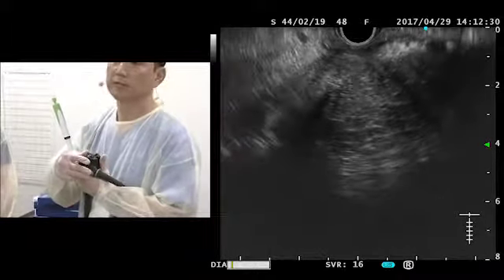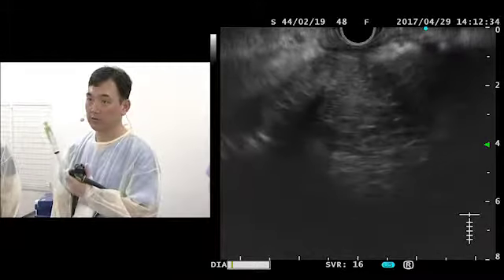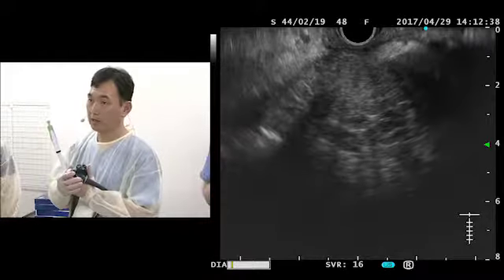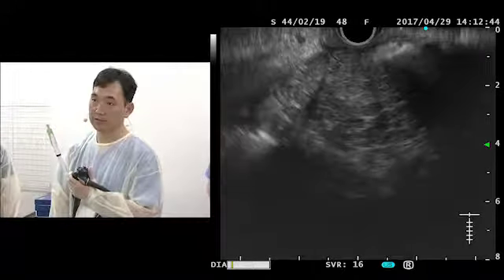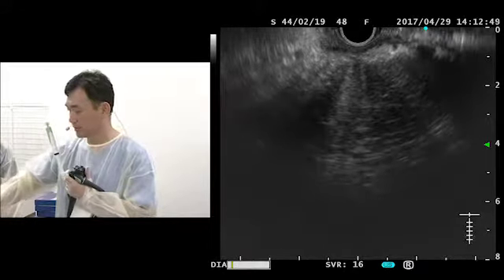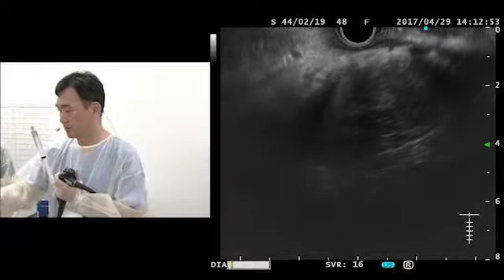So as you mentioned, IgG4 negativity does not exclude autoimmune pancreatitis. That's one of the reasons I chose more of a core biopsy needle than FNA needles, which provides a potential chance of special IgG4 staining as well, and to look for plasma cells in tissue.